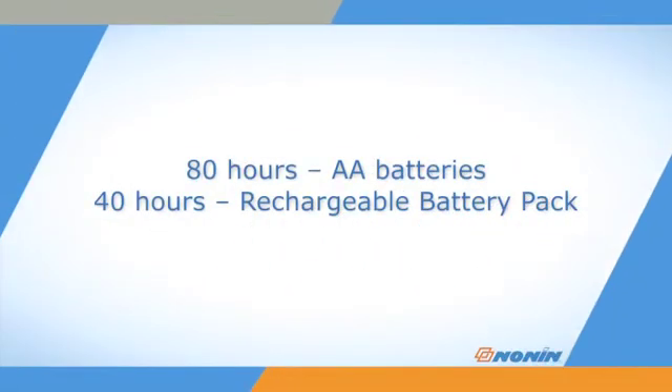The PalmSat oximeter will provide about 80 hours of continuous use with four fresh batteries, or 40 hours of continuous use with the rechargeable battery pack.